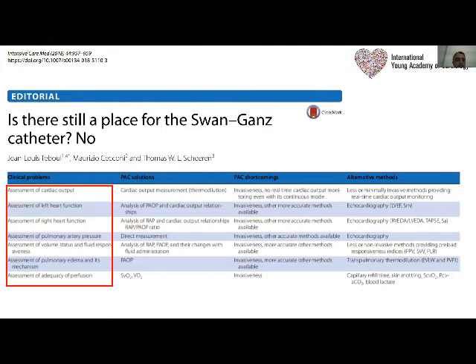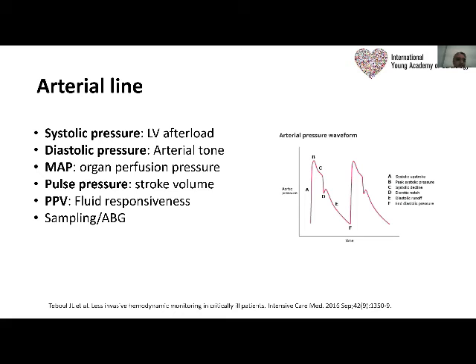They said that for all the clinical questions that you can get answered from the Swan-Ganz, you can have alternative methods which are less invasive, like echo, non-invasive or minimally invasive monitors, or clinical assessment, which can answer all these questions instead of the Swan-Ganz. They even said in a nice paragraph that the place of the Swan-Ganz now is the medicine museum, not the clinical situations.